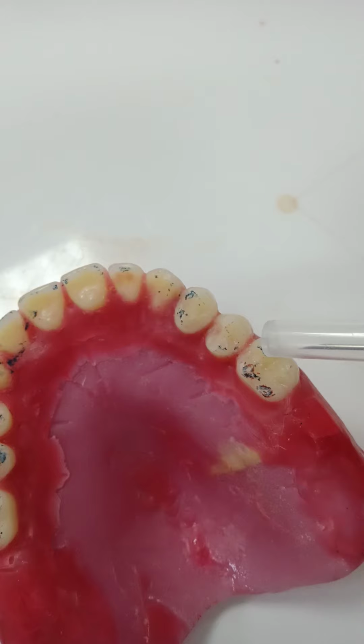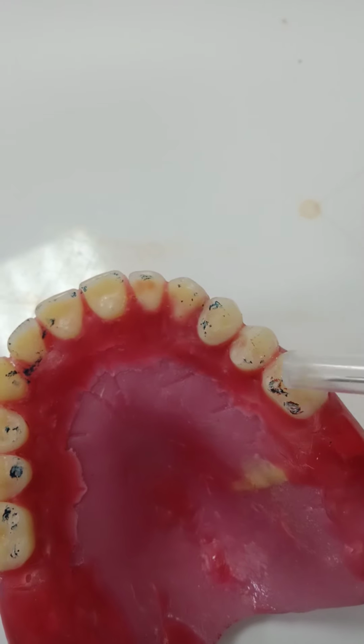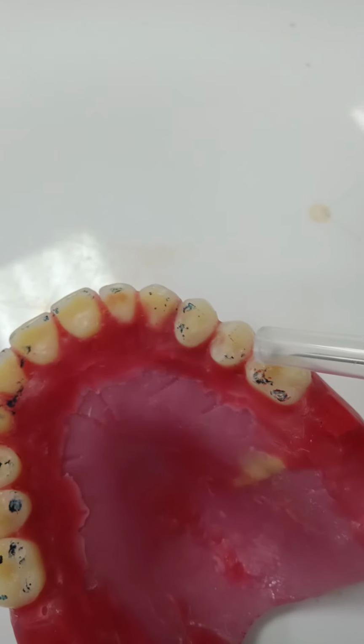So what are we going to do? We're going to do the curve of Wilson, the lateral curve. So this six and this six, now they are both on the occlusal table. When we put them on and check them on the table, they are both on the occlusal table. I want to raise this to create the curve of Wilson. So this is how you do it.